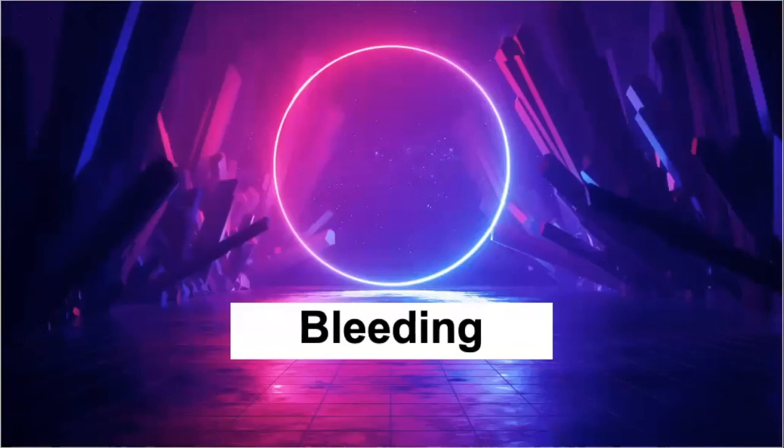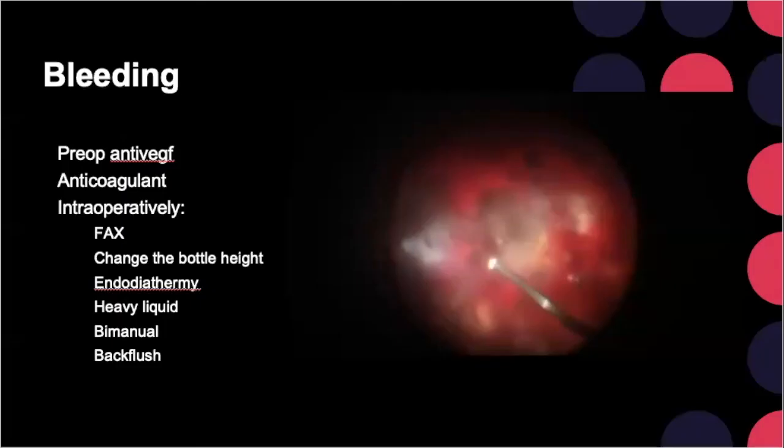Now, the issue of bleeding. To deal with intraoperative bleeding, the control has to start even before the surgery. So we give them anti-VEGF preoperatively. We omit all the anticoagulants safely with the help of our physician. And intraoperatively, if the bleeding still occurs, the common thing that we do is to change the bottle height. The normal bottle height we keep at 25 to 30 millimeters of mercury, but the moment we have a bit of bleeding, we might increase the bottle height. Frankly speaking, I do not like to do this. We know that this patient already has compromised blood flow to the optic nerve.